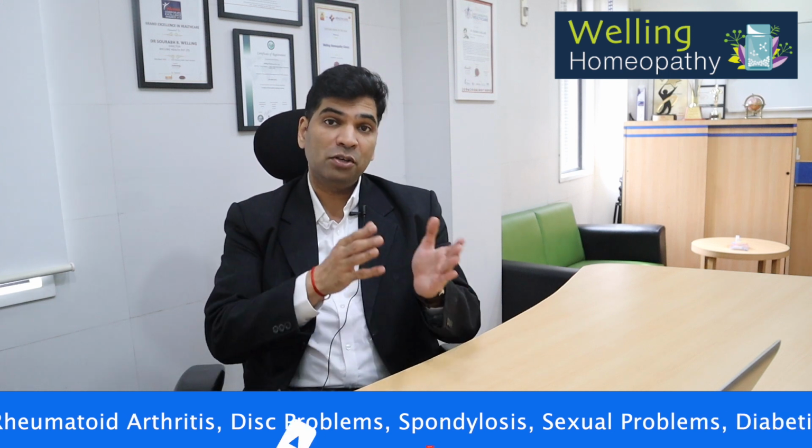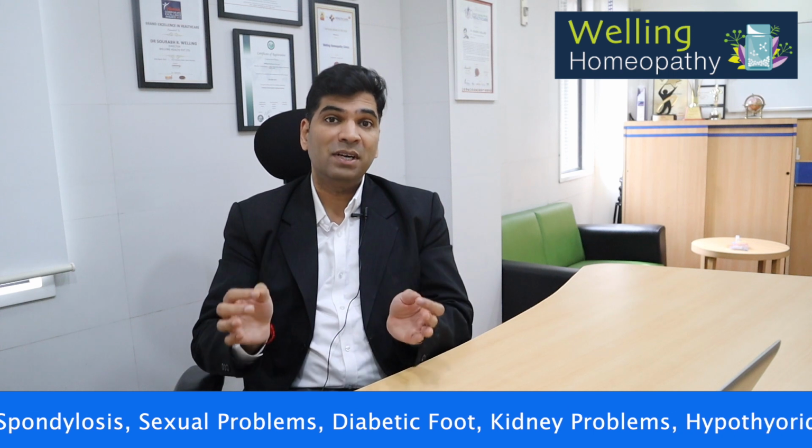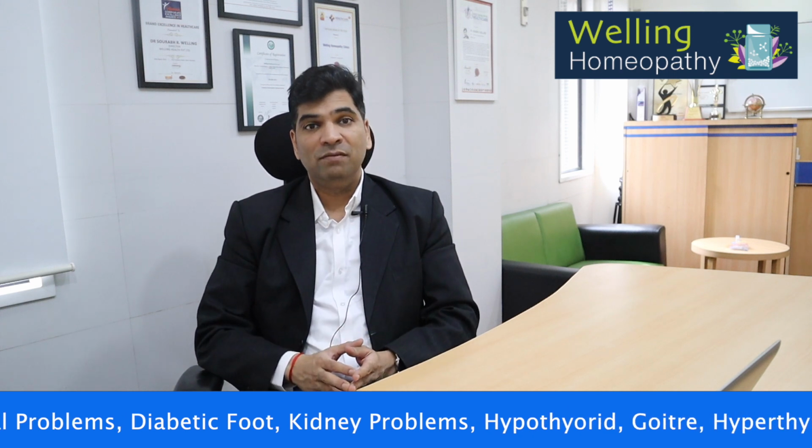It's ideal to have sex 2 to 3 days prior to ovulation. And that you can do only when you know the approximate day of your ovulation, which can be tested in the earlier cycles. So this ovulation kit can just confirm if the ovulation is happening as expected.